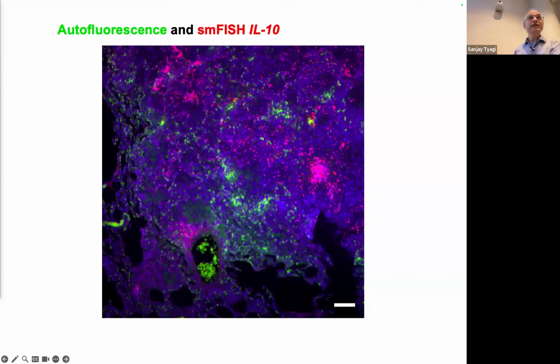Similarly, this is IL-10. I should say that when cytokines are expressed at very high levels, they become the dominant RNA in the cell, and so they're relatively simple to detect. And this seems to be present. So I'm going to just show you the granuloma. This is unaffected tissue. That's the core of the granuloma.